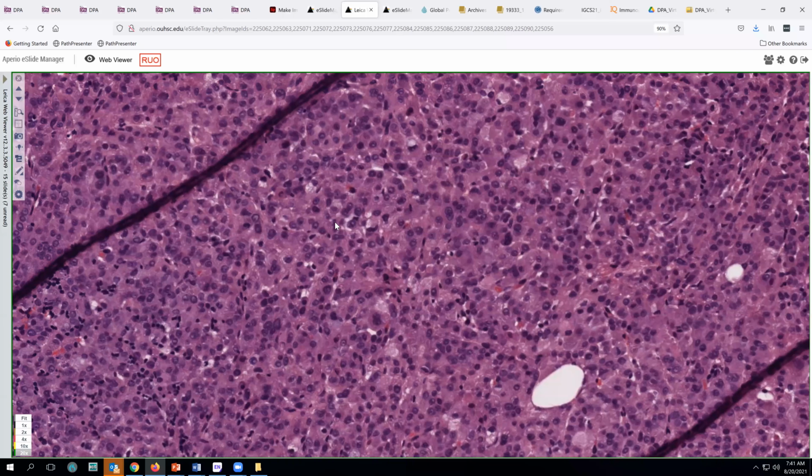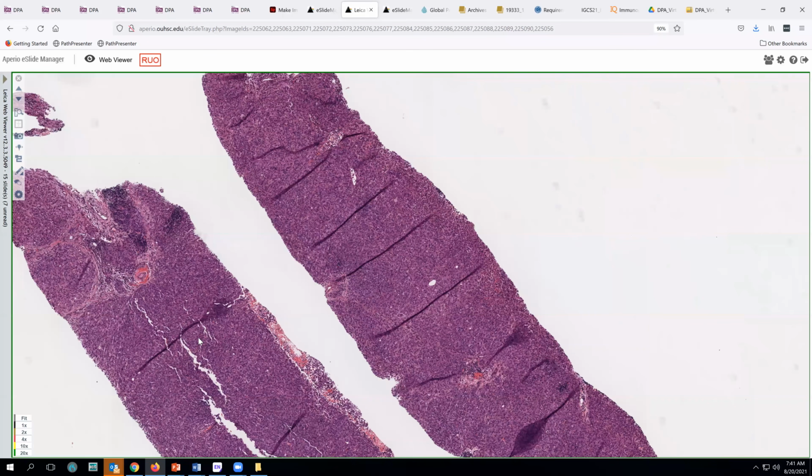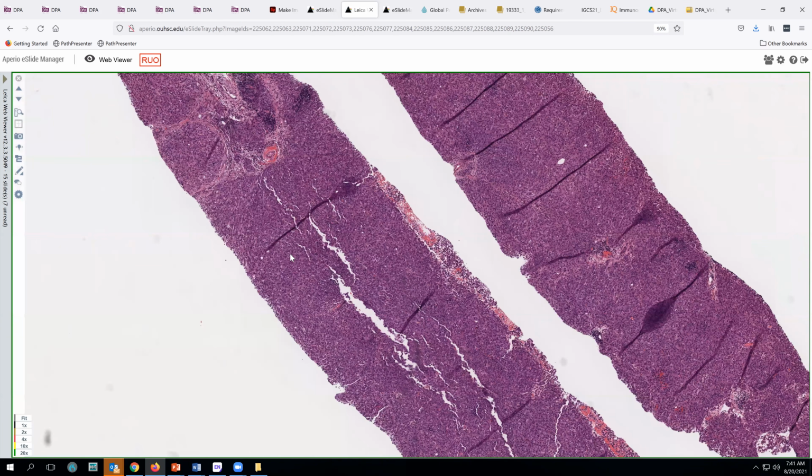But I again emphasize that you do not have to use the Nottingham grade on samples obtained from lymph node, liver, bone, et cetera, et cetera. Its predictive value is not validated in those sites. So metastatic breast carcinoma involving an axillary lymph node, probably moderately differentiated type of lesion.